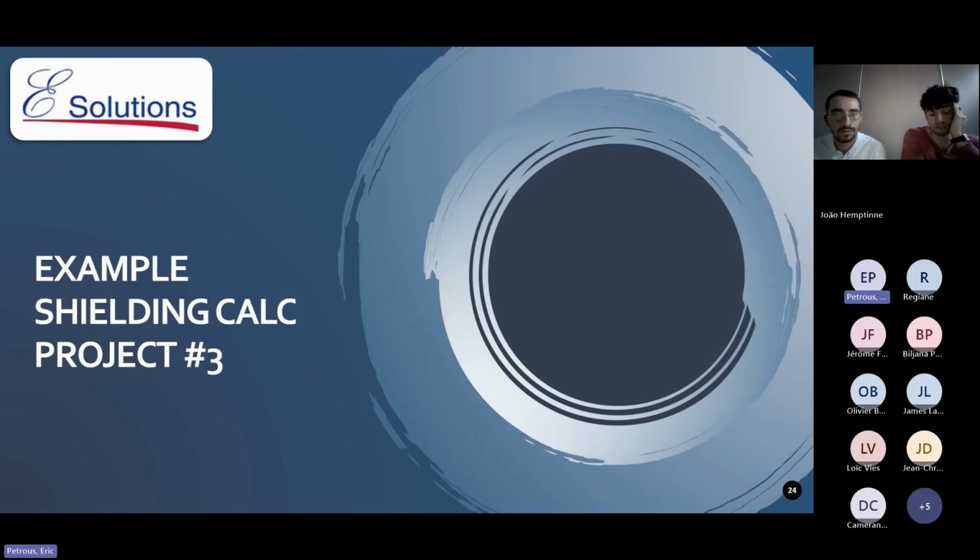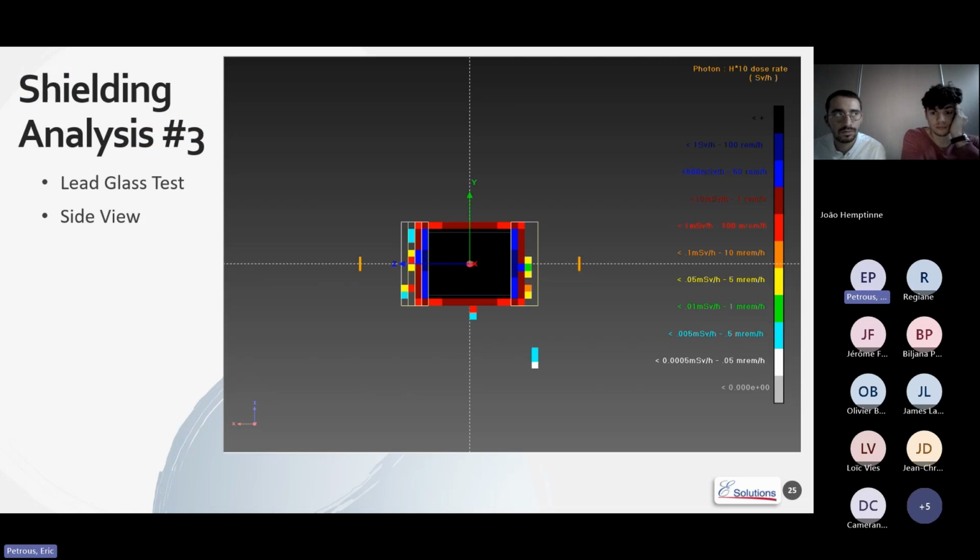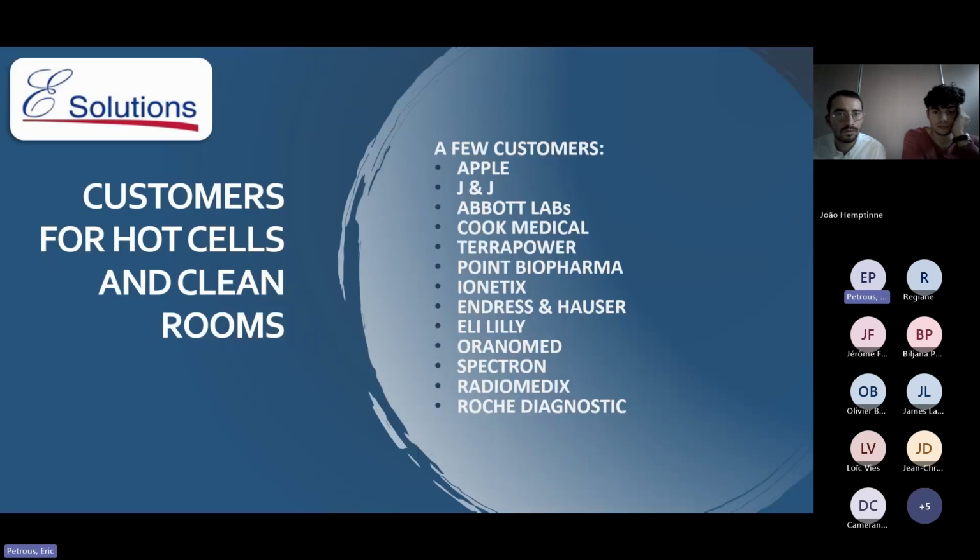But we also can use RayXpert to do much more simple simulations. So for this one, we were just looking at testing some lead glass. For the specific one, we were looking at multiple panes of glass versus one pane of equivalent thickness. And on this test, we actually didn't even bother showing the results from it because it was zeros across the board. So it meant that we had plenty of shielding on those windows. And then we have a list of a few of our customers that we've worked with currently and in the past.